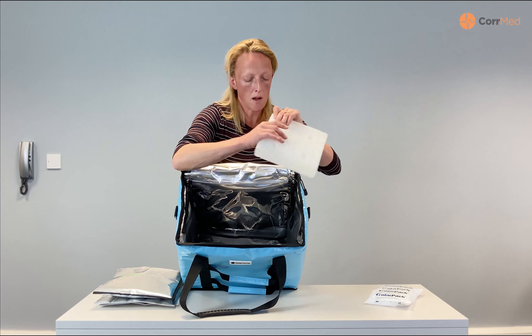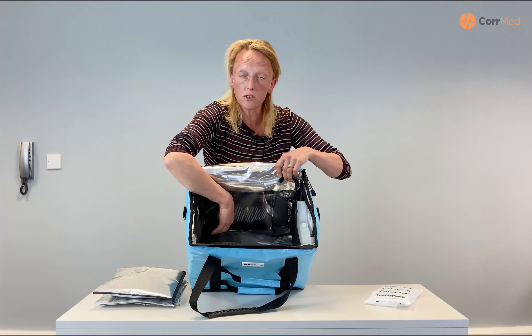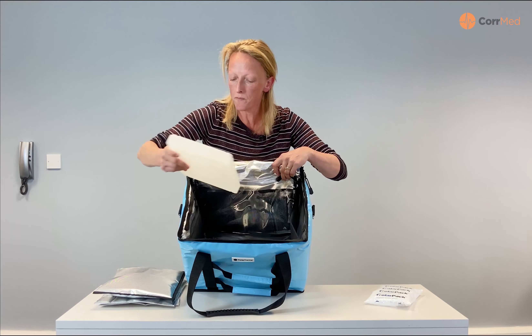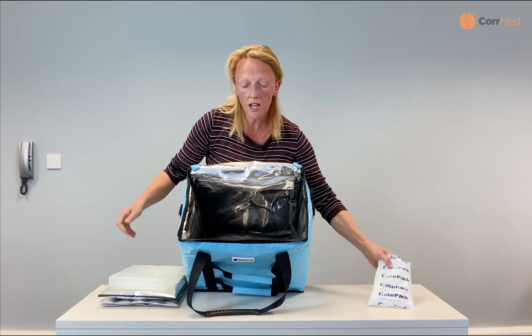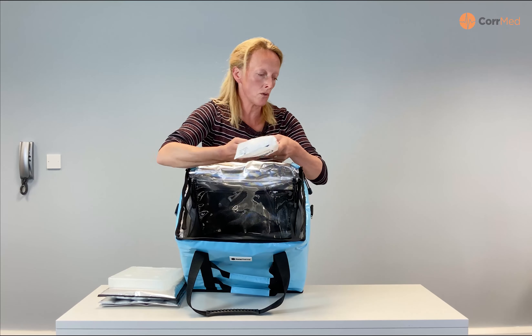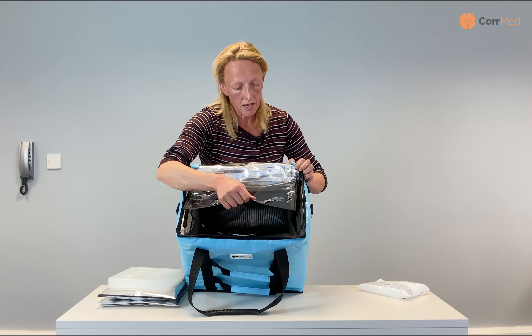Very important because of infection control — you're going to be keeping these bags clean and you want to make sure that everything is protected nicely. On these bags we have ladder handles, so if you are two people carrying the bag and you're the same height it will stay level. If you're different heights you can grab a different handle according to your height to ensure that it stays level.